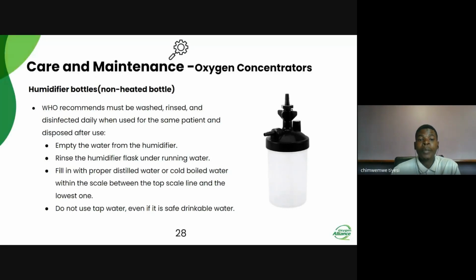If you're using it on the same patient, of course, you can use it multiple times. But if you want to use it on a different patient, you need to discard it and throw it away in designated waste management bins. The World Health Organization recommends that you empty the water bottle from the humidifier, rinse the humidifier flask under running water, and fill it with properly distilled water, or you can put in cold water that has been previously boiled.